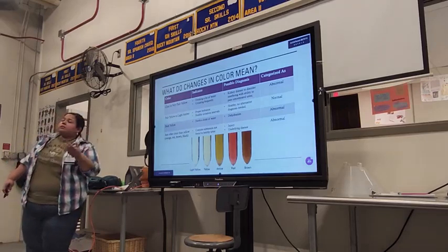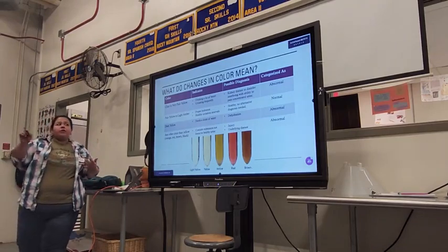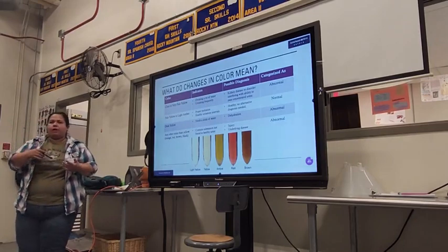If we look at the next one, pale yellow to light amber, this one typically signifies that there's proper hydration going on and that their urination intervals are at a healthy time frame from each other, okay?